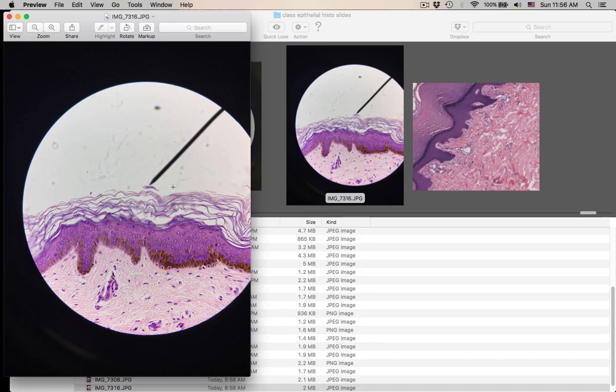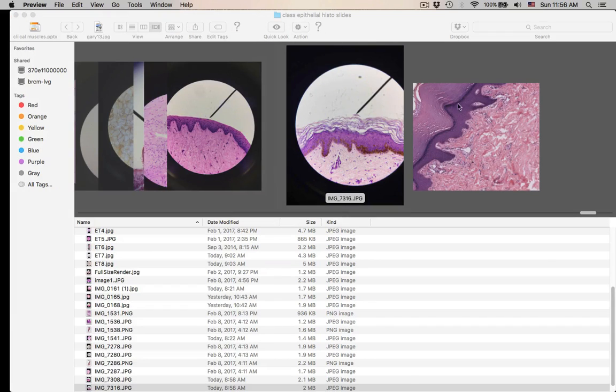This is the epidermis of the skin. This bottom layer is the stratum basale. The base layer, stratum basale. What cell that lives down in the stratum basale makes this brown pigment? You can't see them, but you can see their pigment. That is melanocytes. So that was number 31, stratum basale. Those are melanocytes that are making that pigment.